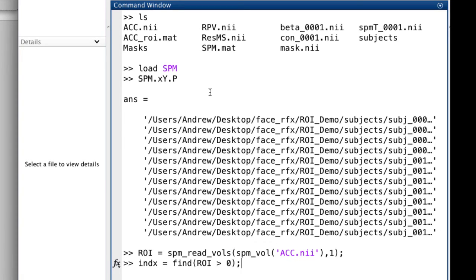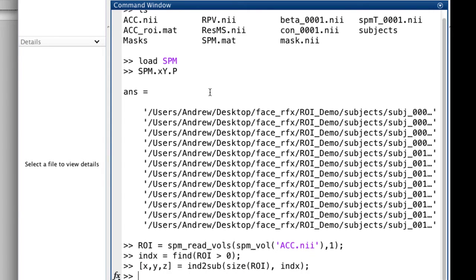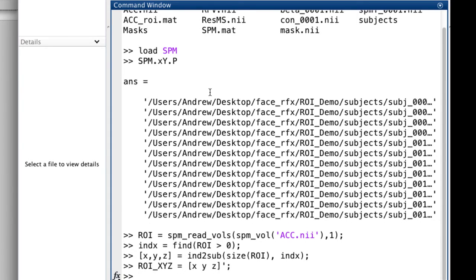Basically, it converts the ROI to a series of XYZ coordinates and then submits it, along with the paths to all the contrast images, to a command called spm_get_data.